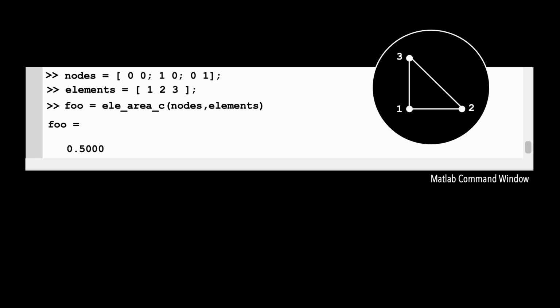If MATLAB cannot find the function, check that your path setup agrees with your installation location and that you have permissions to access the directories and files. A second potential problem is considered in the next section.